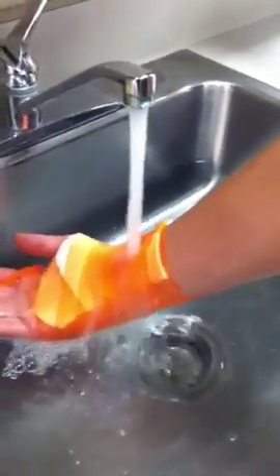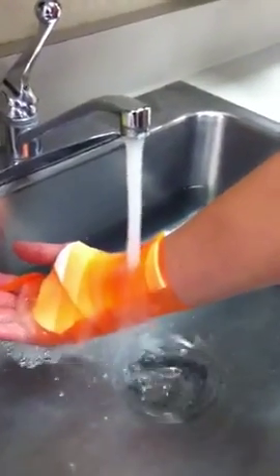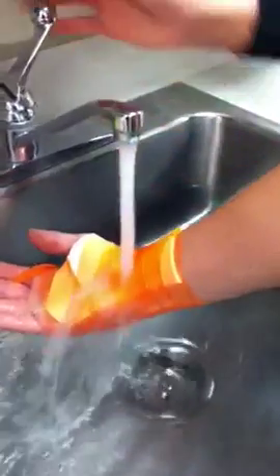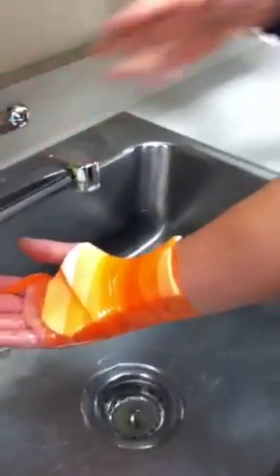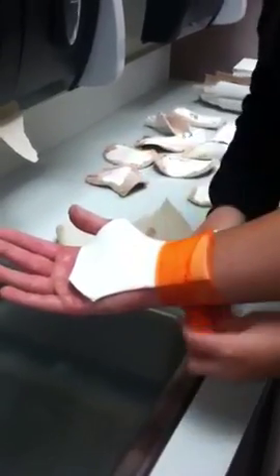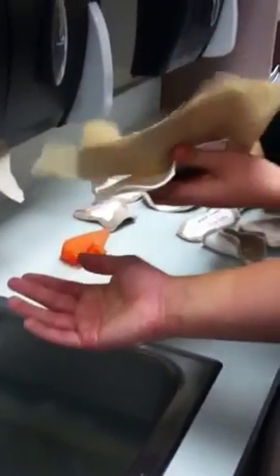If you can take it off, depending on what joint you're mobilizing, you can take it off and just lay the splint in the cold water. We're going to pull this out of here right now. We're going to take the pre-wrap off, and then we're going to dry it off. We're just going to take some paper towels and dab this brace dry.